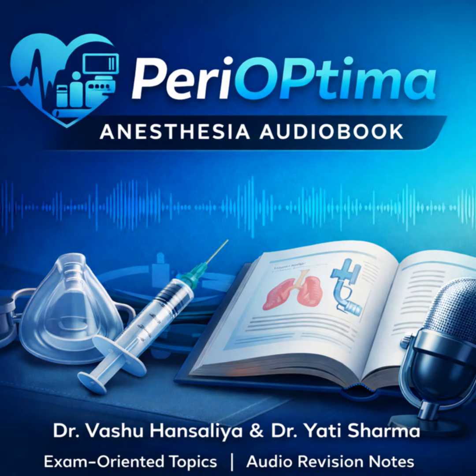This brings us to the area where VL really proves its worth. The role of video laryngoscopy in the difficult airway. This is its home turf. VLs are now considered indispensable, not just for the known or predicted difficult airway, but for the unexpected one you encounter at 3 a.m. Why are they so good when you're anticipating a tough intubation? Because they can give you that great glottic view, changing a grade 3 to a grade 1 without needing all the force and tissue manipulation that DL requires. This is especially true in cases of an anterior larynx or a large tongue. They're so effective that they're now formally part of the ASA difficult airway algorithm.